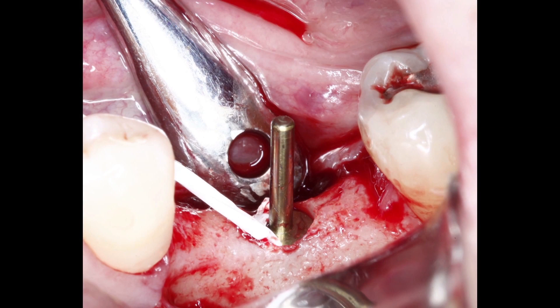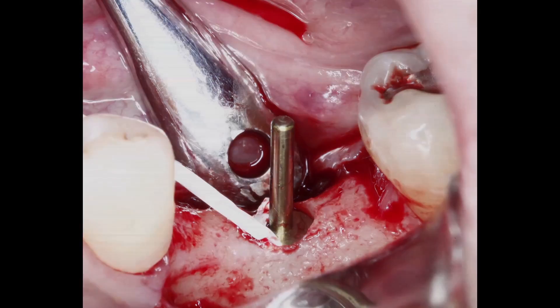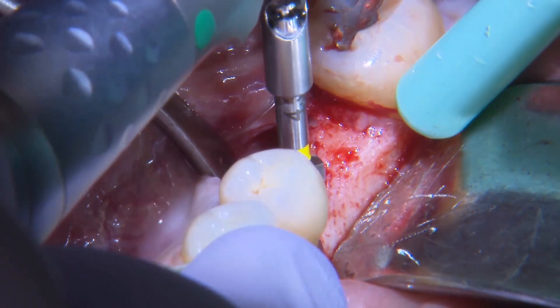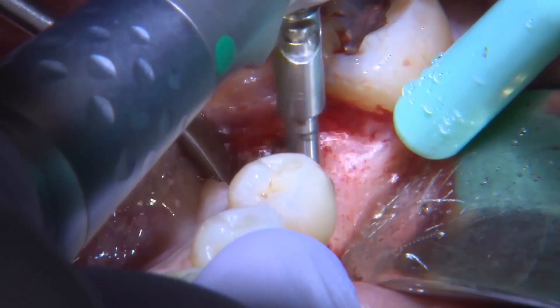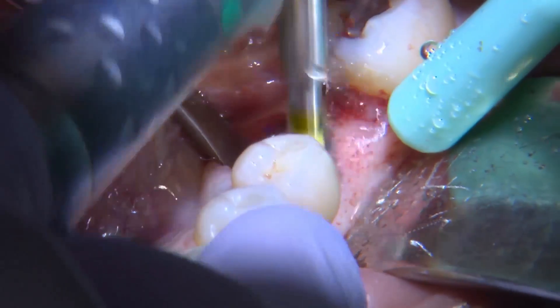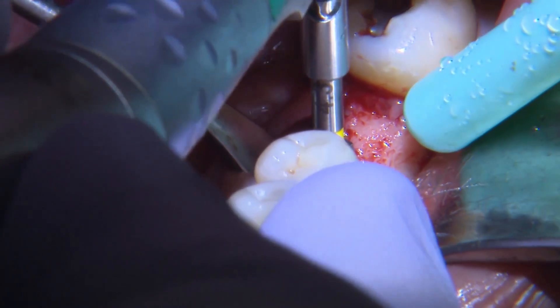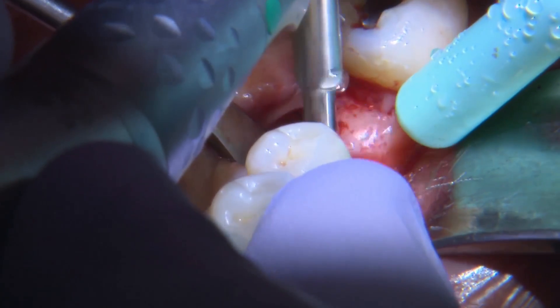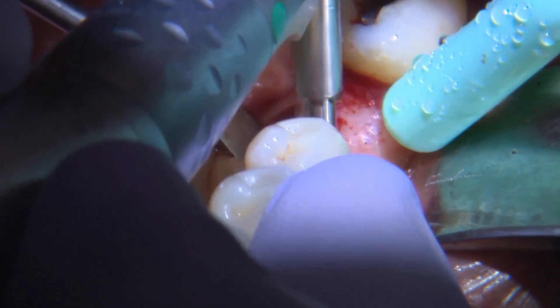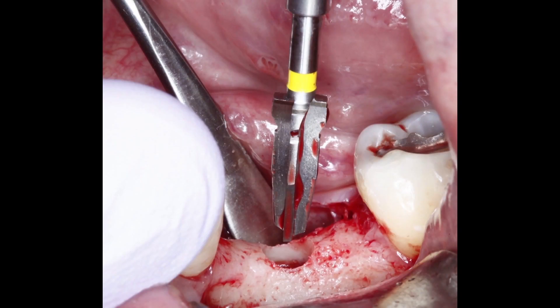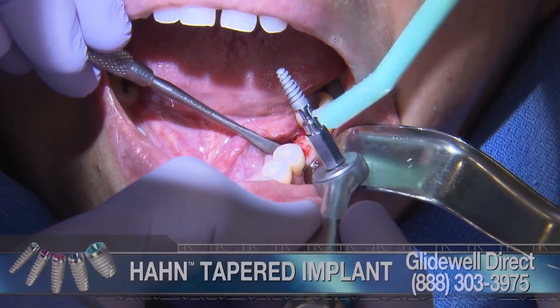It's a very systematic process — you don't just go from the start drill to the final shaping drill. You want to move up in width and length of the drill so that you have a chance to correct angulation if you run into any trouble. Moving up through the different drill sizes, I get to the final drill, and in this situation it is a 4.3 by 11.5 millimeter diameter implant, so my final shaping drill is going to match the shape of my implant.